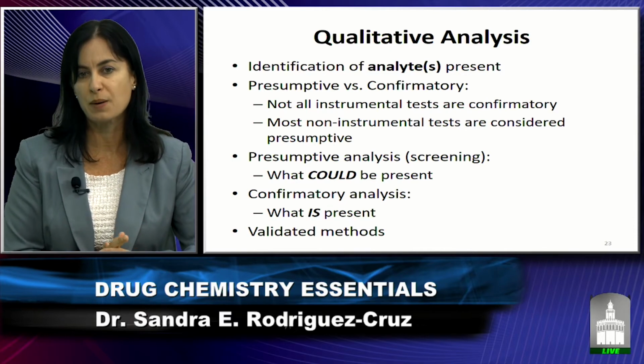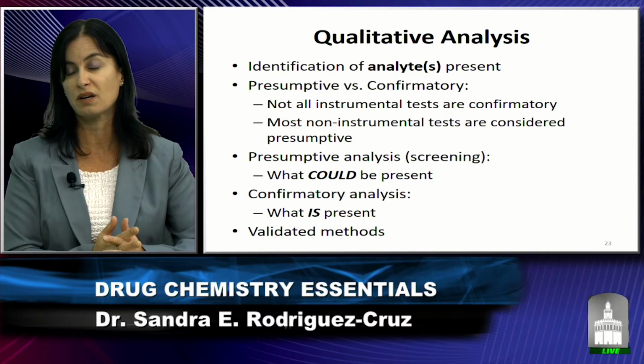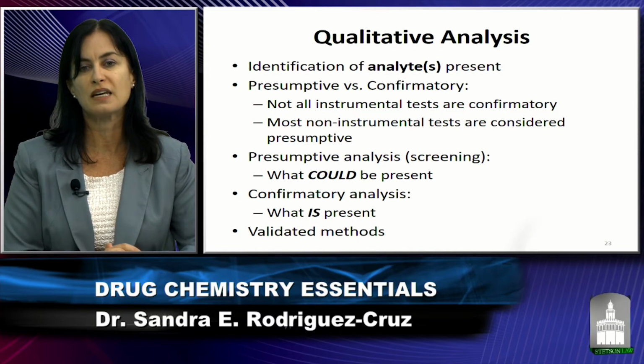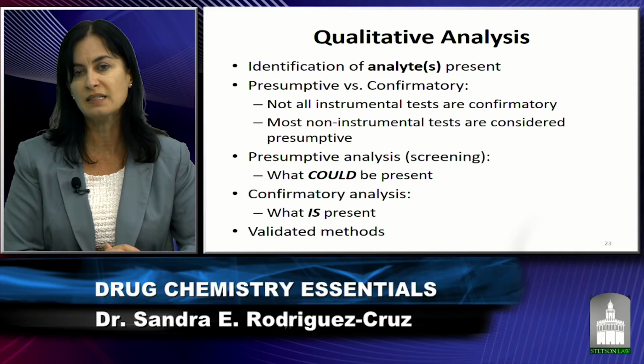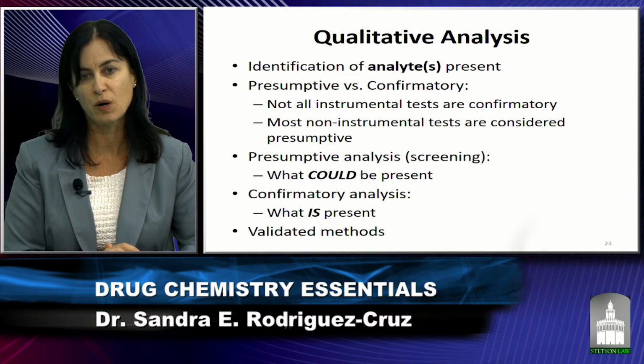And what do we mean by presumptive analysis? A lot of laboratories may call this screening. These tests just give us an indication of what could be present in the sample. They don't tell us with absolute certainty that a compound is present.